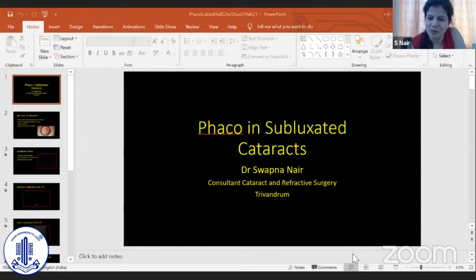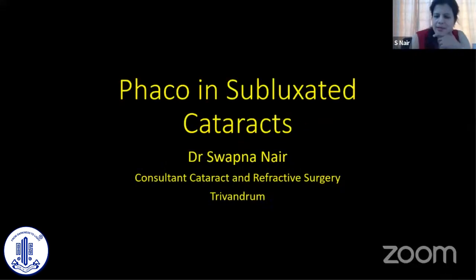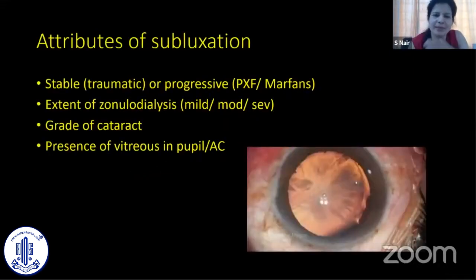Balla mentioned, I'll be talking about phaco emulsification in subluxated cataracts, and I hope my screen is visible. So basically, subluxated cataracts have certain attributes that we need to take into consideration before planning the surgery.